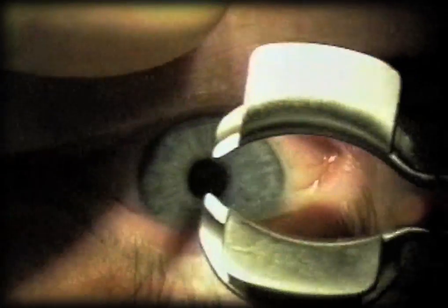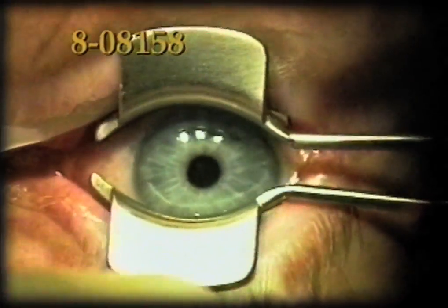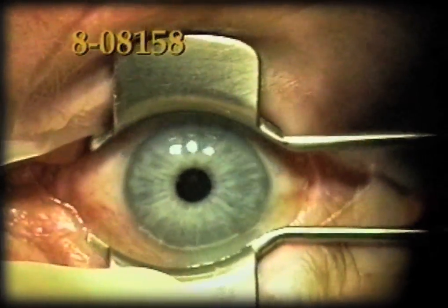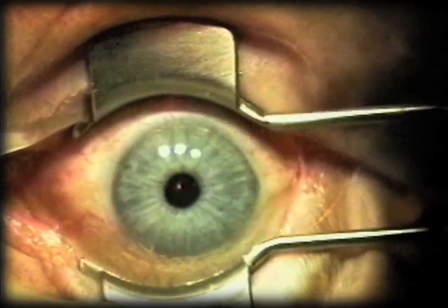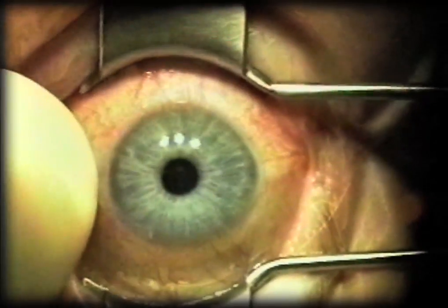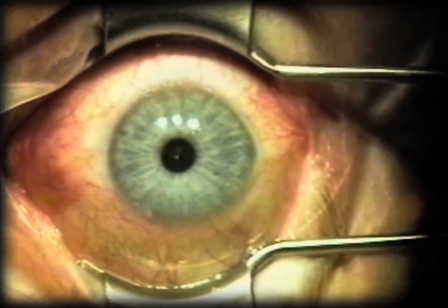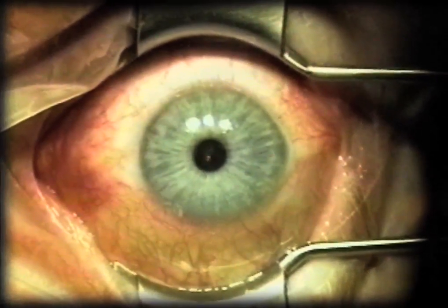The Steiner 2 LASIK Speculum has been designed with several features in mind. The blades are deep enough to keep the lashes and the skin away from the field, and in most patients also gives a good opening adequate for most microkeratomes.